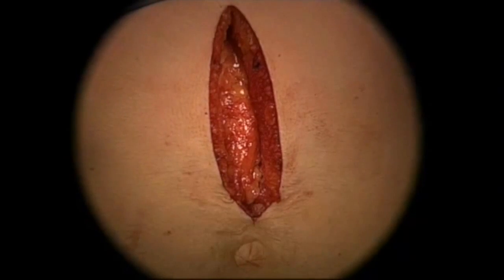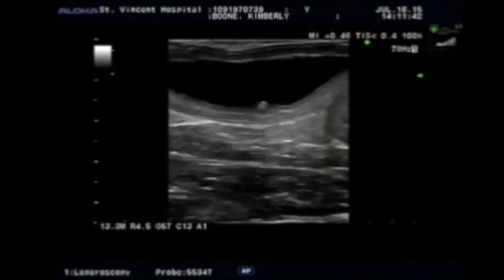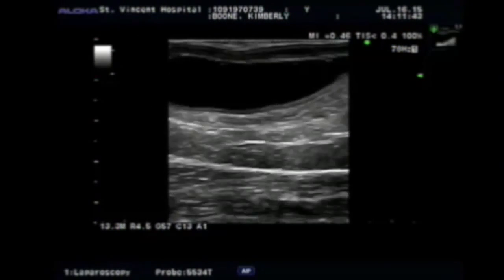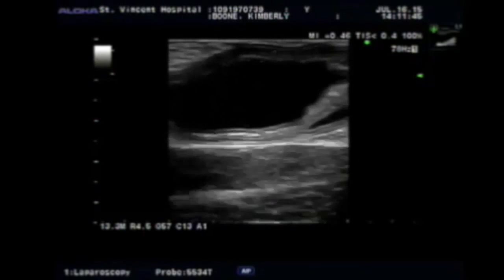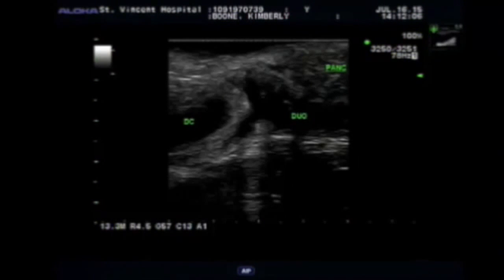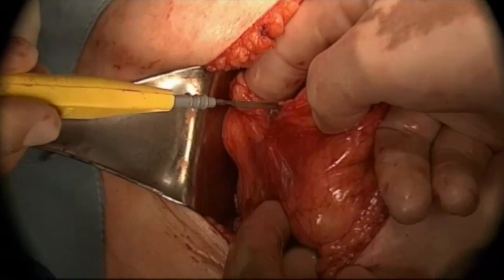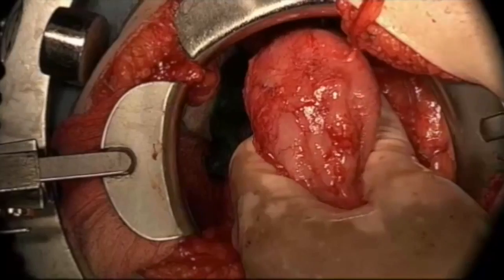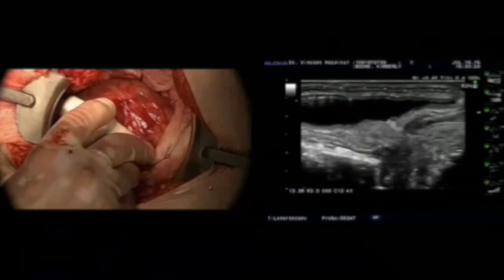We started with a midline laparotomy and then performed intraoperative ultrasound, which revealed the duodenal cyst and the ampulla. We then performed the Kocher maneuver and achieved full mobilization of the duodenum.